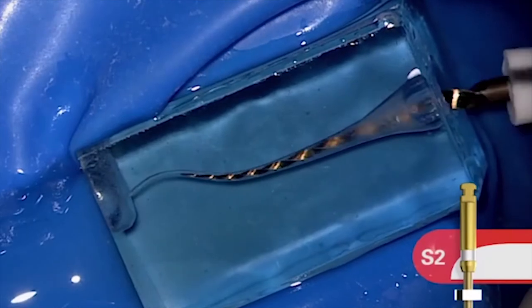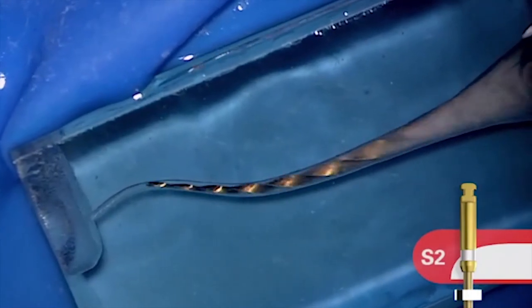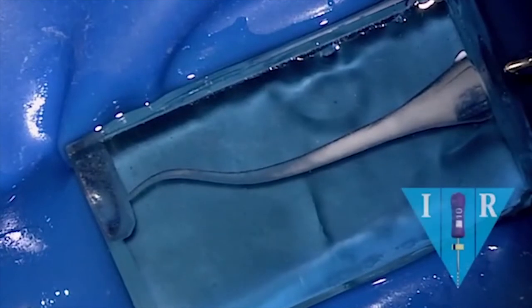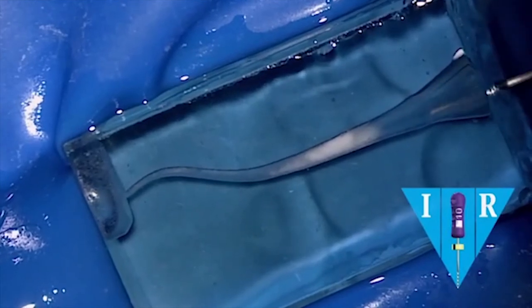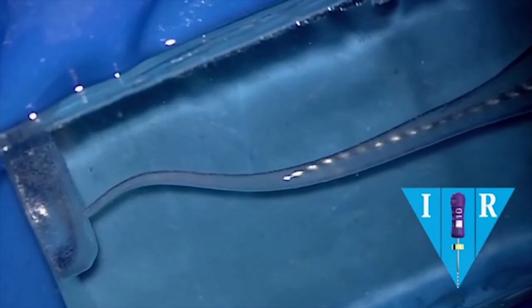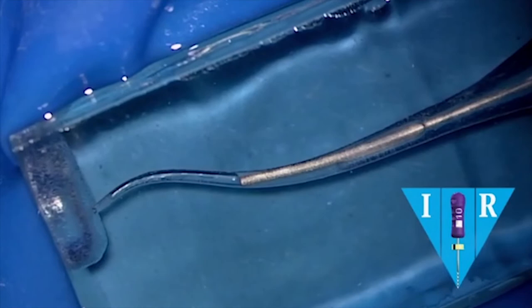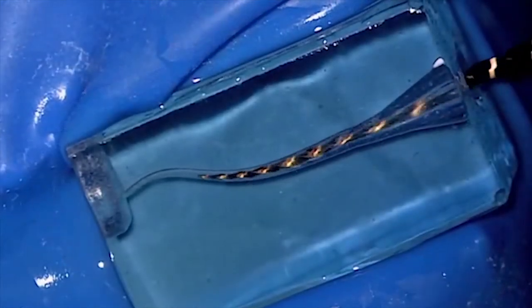Here comes the S2. It'll carry a shaping wave progressively deeper into the canal, and it'll work primarily in the middle one-third. The tip of the file is dominantly loose, and the shaping is continuing. Irrigate, recapitulate, and re-irrigate. I'm using a needle or cannula that is cut 90 degrees to its long axis, which means I can vacuum and bump solutions — I can actually move solutions many, many millimeters apical to the position of the cannula. This is a real advantage in irrigation procedures.